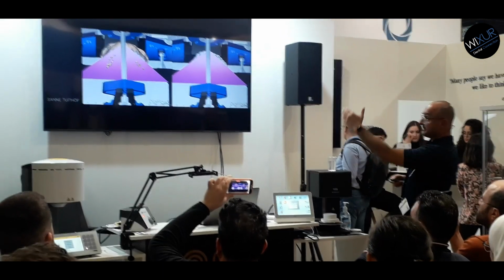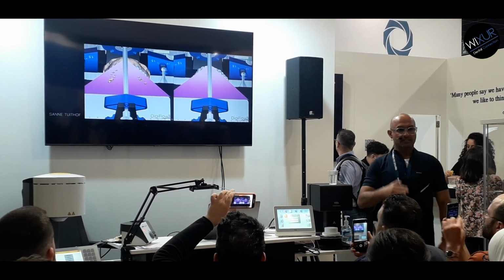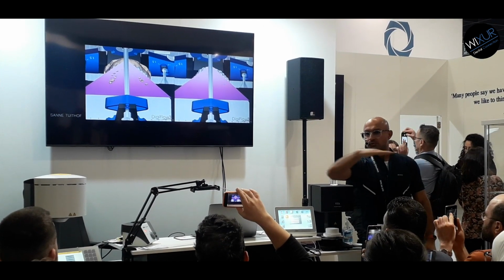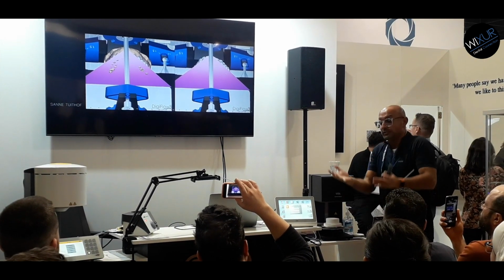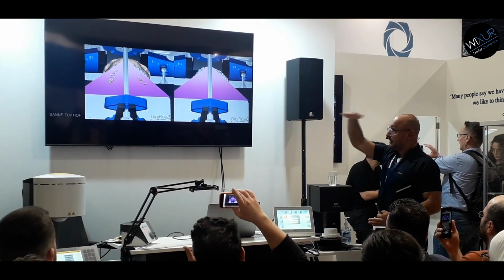And wow, this is wow, because when you work with digital dentistry, you can see the sagittal curve is hanging. This is not healthy. A beautiful curve should be straight, or we have to have a positive curve. And now we have a negative curve. It means we need a lot of orthodontic intrusion to come on the top of the triangle.